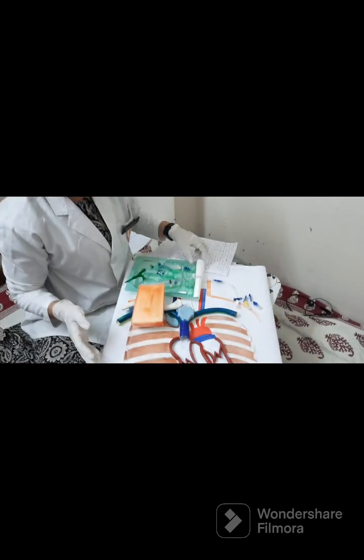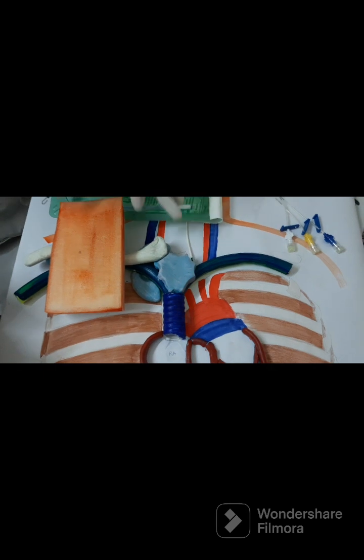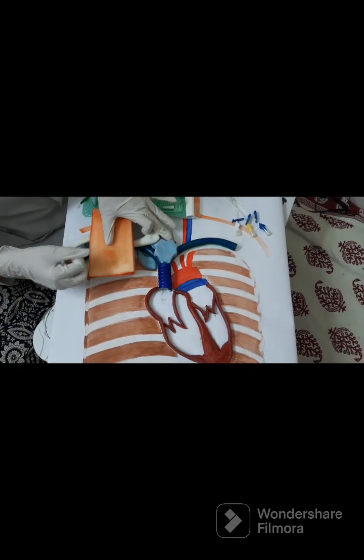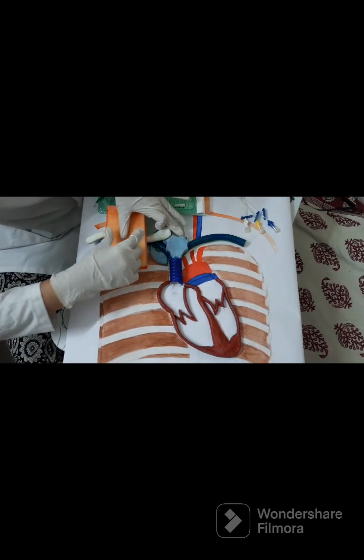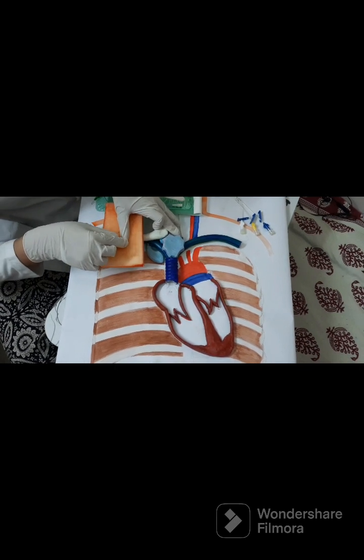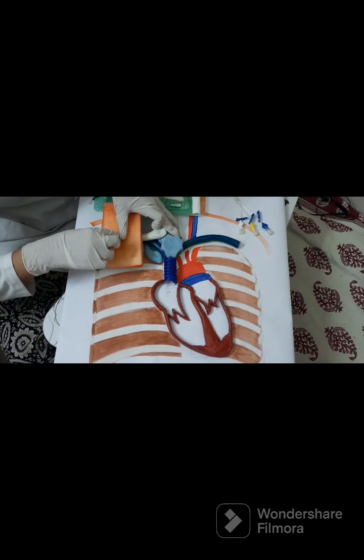This is a simulation model of landmark guided central line insertion via subclavian vein. Now I will demonstrate the procedure to you. Firstly, we'll put our middle finger in the sternal notch as aiming point and thumb in the deltopectoral depression next to the clavicle where it curves, that is between the medial one third and middle one third. This is the deltopectoral depression. Thumb rests against the clavicle. Skin puncture site is just behind the thumb, that is 1.5 centimeter from the clavicle.